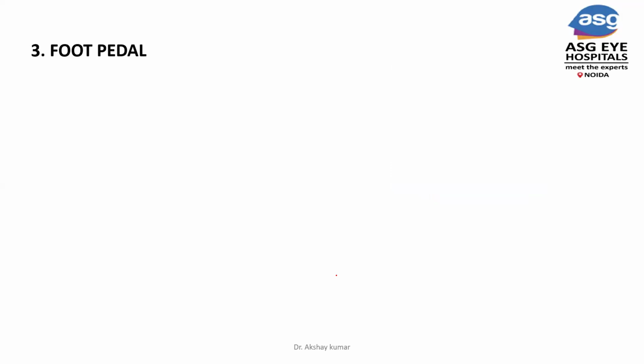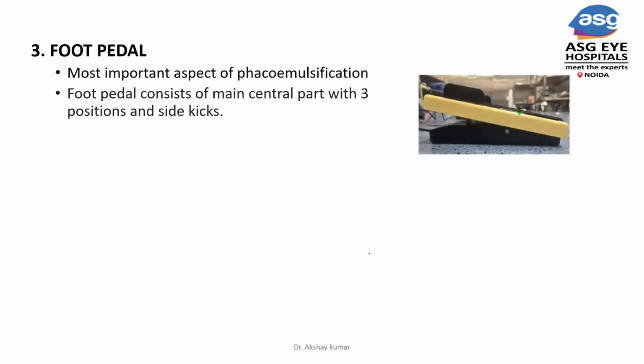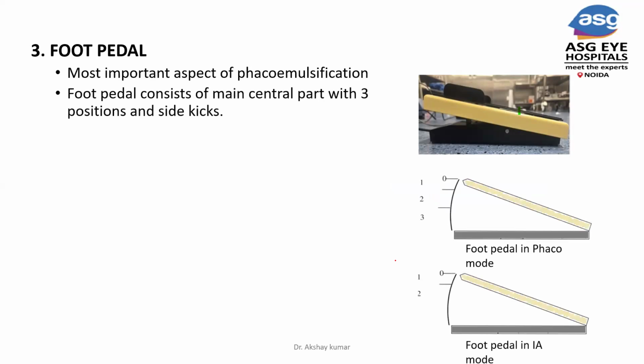Now the most important aspect is the Phaco foot pedal. So this is the foot pedal. It depends at which mode you are operating. In a Phaco mode, you have three modes through three positions. First is the irrigation only, then the irrigation and aspiration, and third is the irrigation, aspiration, and ultrasound energy. And if you are operating in an irrigation and aspiration mode, you have irrigation and aspiration only.